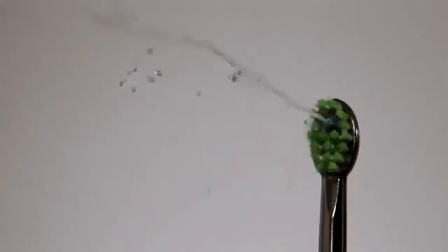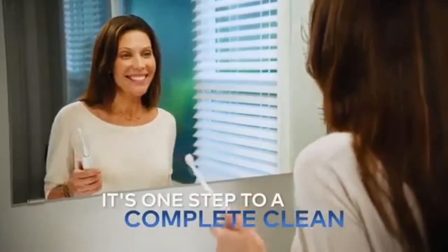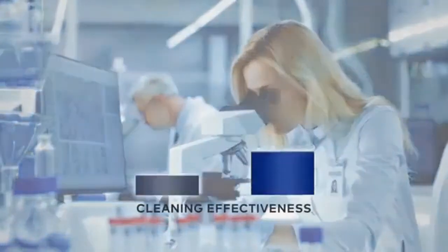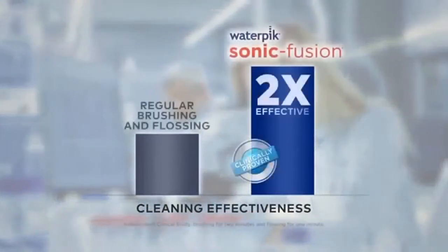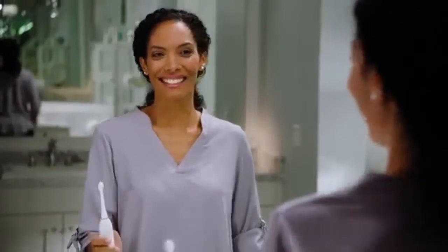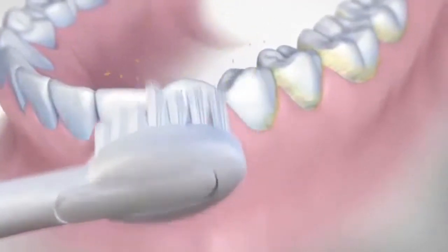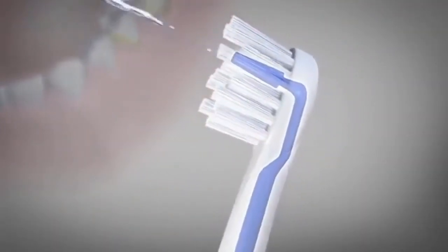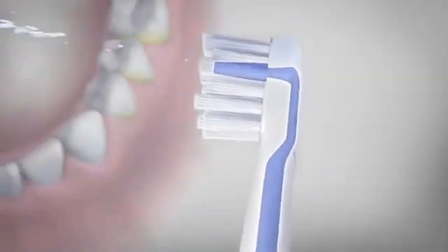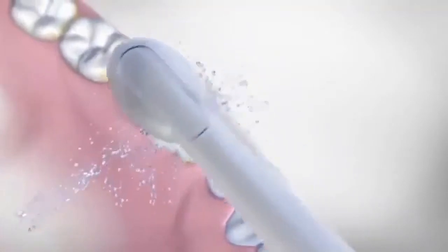Introducing Water Pik Sonic Fusion, the world's first and only flossing toothbrush — now you can brush and floss at the same time. In a recent clinical study, Water Pik Sonic Fusion was shown to be twice as effective as regular brushing and flossing for removing plaque and improving gum health. The sonic toothbrush effectively cleans the surfaces of your teeth while the built-in water flosser pulses water from the center of the toothbrush, cleaning in between teeth and below the gum line.